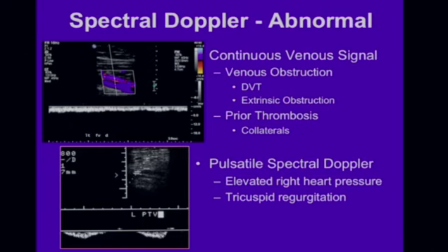We also use bilateral symmetry to help us, and so if there are cases of subtle loss of variation, that will be seen by comparing one side to the other. In all cases of the lower extremity, at a minimum, we compare either the common femoral vein or iliac vein from side to side.